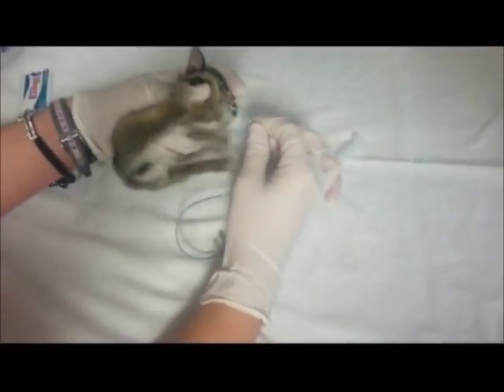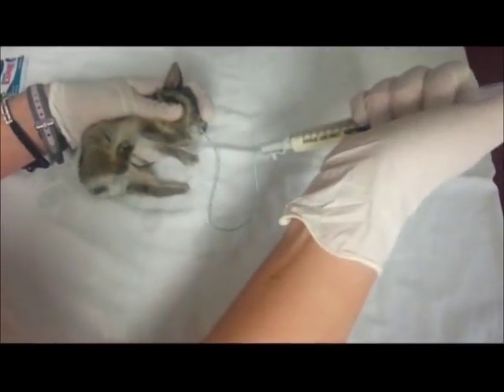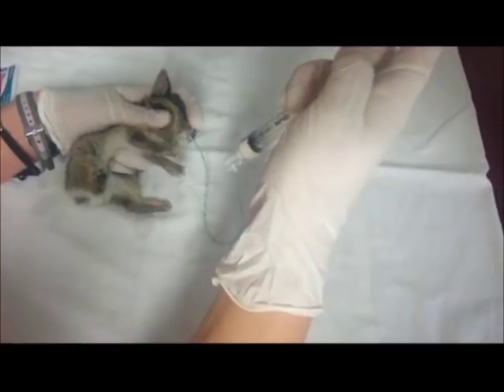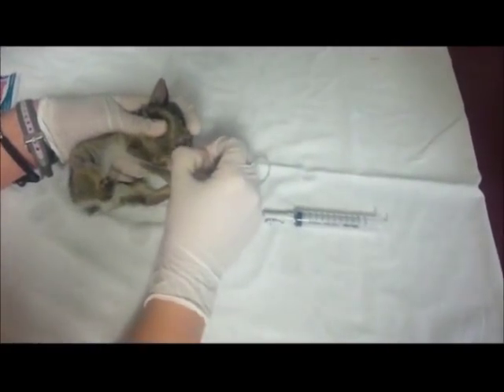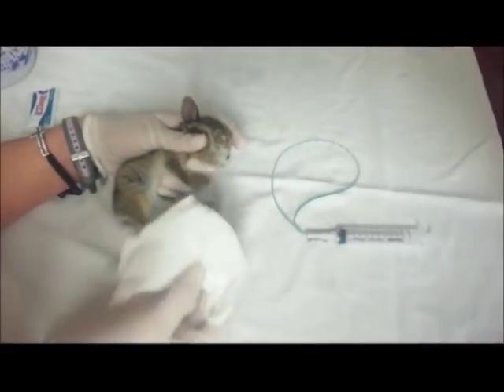Once you have got to the mark on the tube, begin by putting 0.1cc down the tube and wait a little bit to make sure no formula comes out of their nose. If no formula comes up, slowly feed the bunny the amount it should be getting for the feeding. Pinch the tube at the end and slowly pull out.